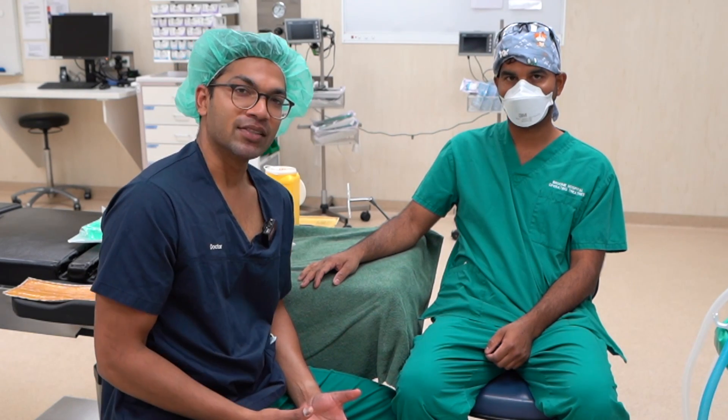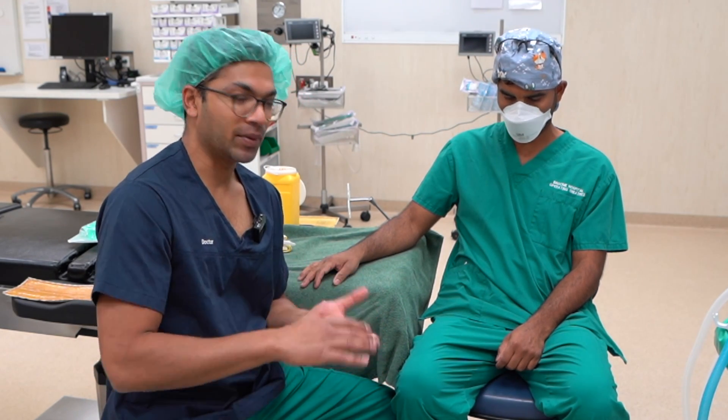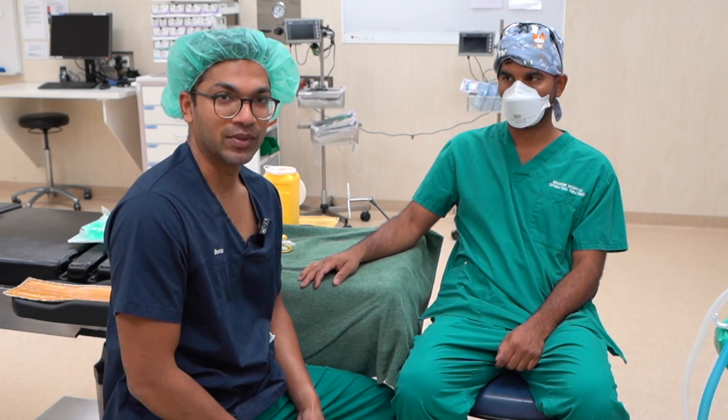Notice that this time I'm putting a towel underneath my patient's arm. That's because blueys, which we traditionally use — great for absorbing and keeping the area waterproof — are really bad for the environment and can stay in landfill for over 100 years. So that's why I'm using a towel that's easily washable.